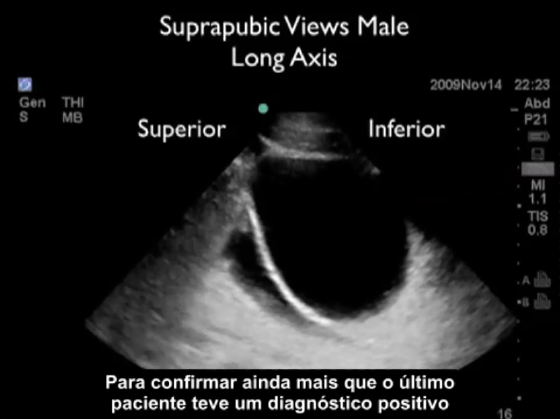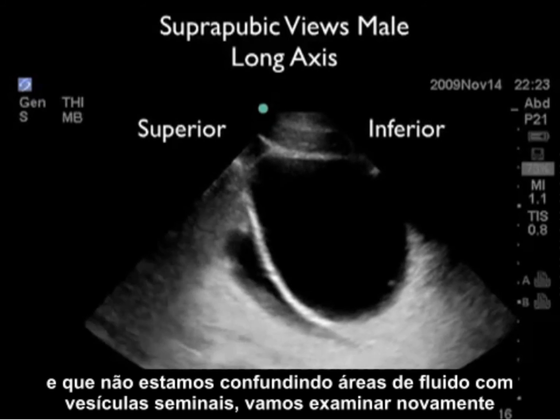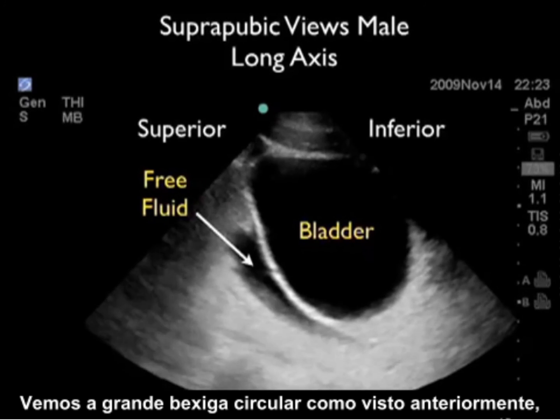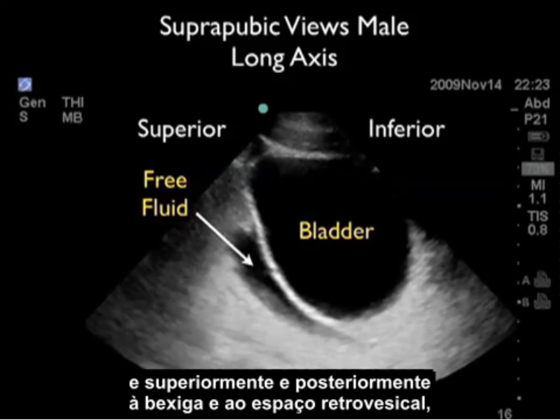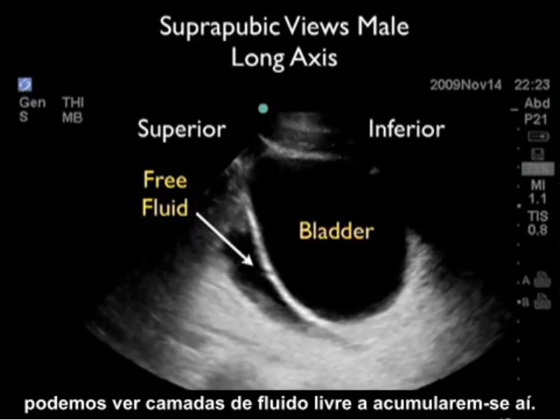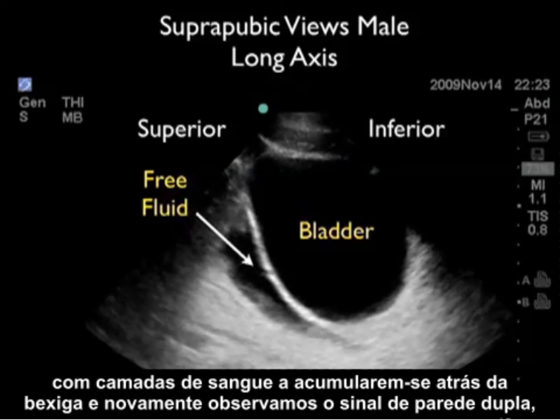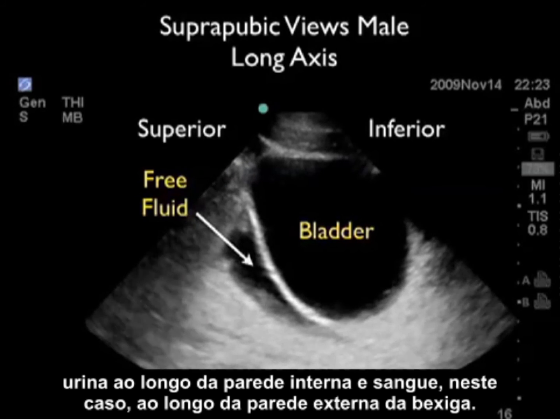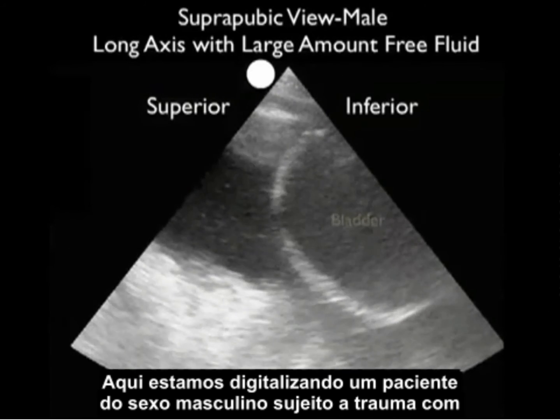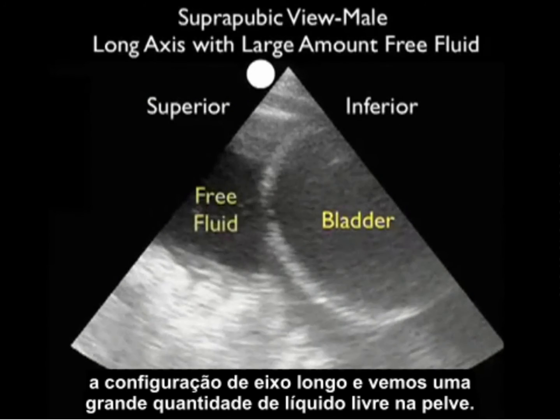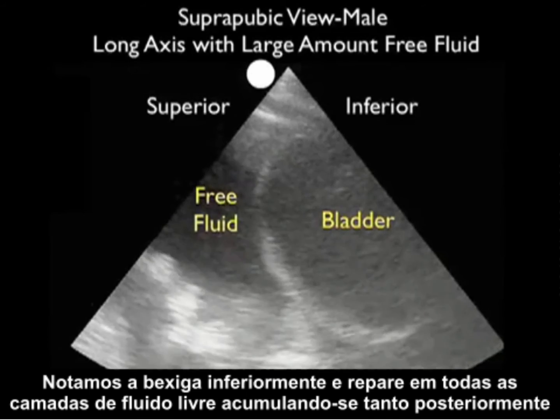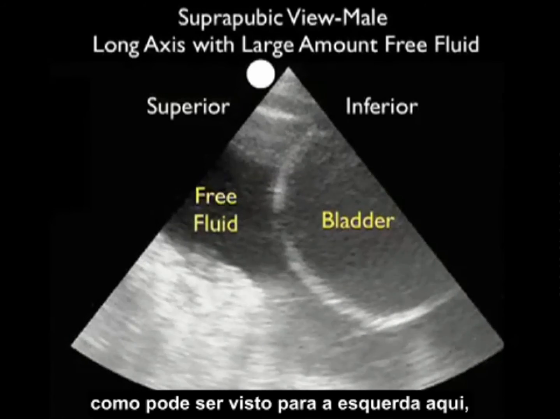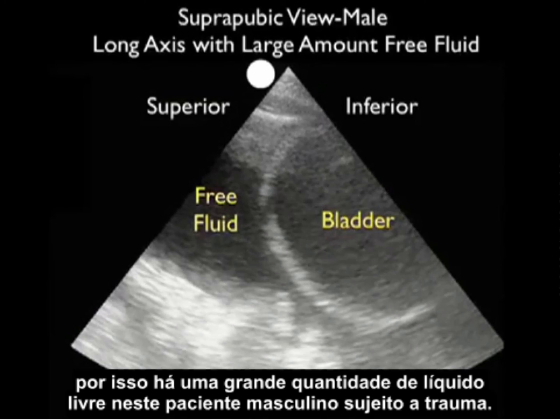To further confirm that the last patient had a positive exam and that we're not mistaking the areas of fluid for seminal vesicles, we'll rescan the patient in the long axis plane, superior to the left, inferior to the right. We see the large circular bladder anteriorly, and superior and posterior to the bladder in the retrovesical space, we can see free fluid layering out. This confirms the patient has a positive exam with blood layering out behind the bladder, and again we see the double wall sign — urine outlining the inner wall and blood outlining the outer wall. Here we're scanning another male trauma patient in long axis, showing a large amount of free fluid within the pelvis, both posterior to the bladder in the retrovesical space and coming anteriorly onto the dome of the bladder.